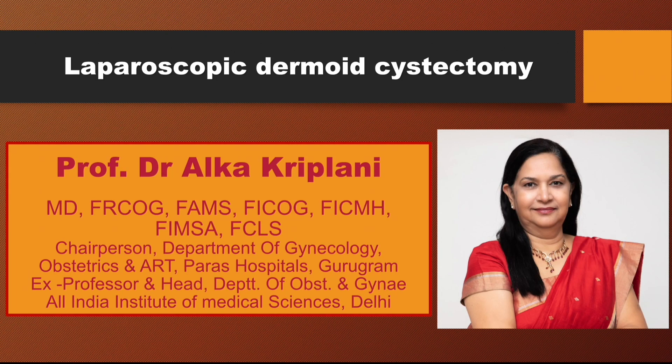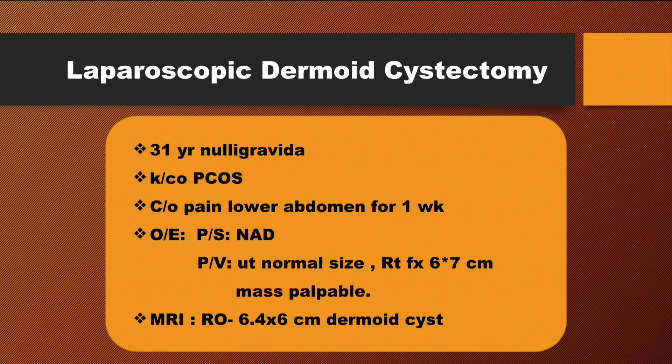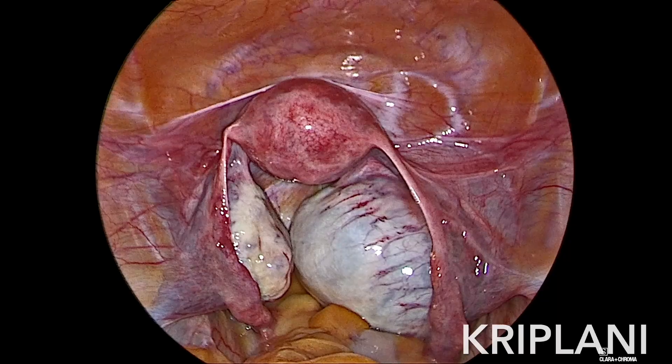In this video, we are showing the procedure of laparoscopic dermoid cystectomy. This 31-year-old patient's complaint of severe pain in the abdomen — she had PCOS and her imaging showed a 6 cm cyst in the right ovary.